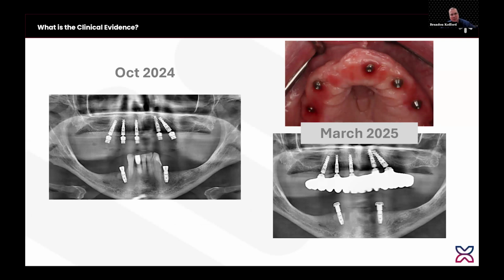Now this one's really interesting because everybody's worried about the orientation screw loosening. And I always tell people it is not necessary for that orientation screw to stay tight. The orientation screw is not even necessary. So if you look real close at these abutments, these are our version of the Omnibut that don't even have an orientation screw. These aren't commercially available. We were just testing it out. And I really like it.